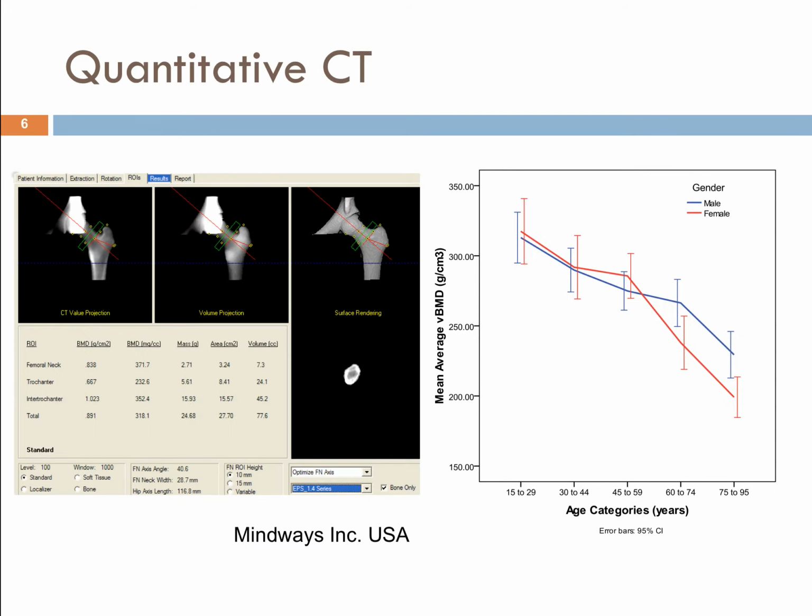The other advantage, I was talking in the introduction about being able not just to look at qualitative changes, like before even with the dental images, we saw the dentition, we saw the soft tissues of the face, and we saw the hard tissues of both the dentition and the mandible and maxilla. But what we can also do with CT technology is we can look at things from a quantitative viewpoint.